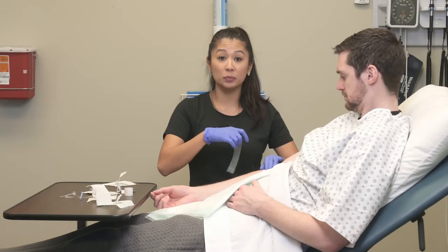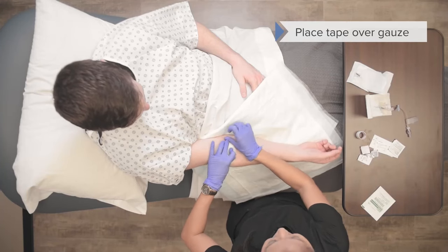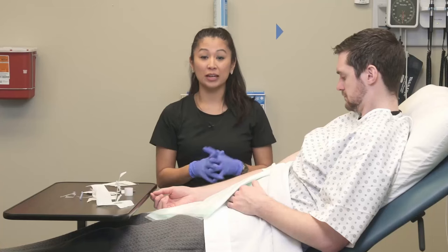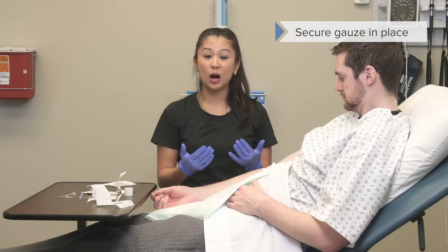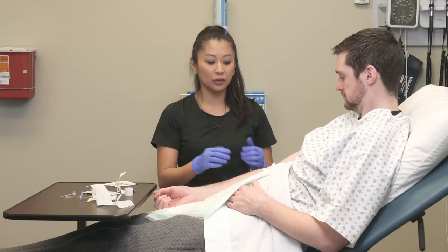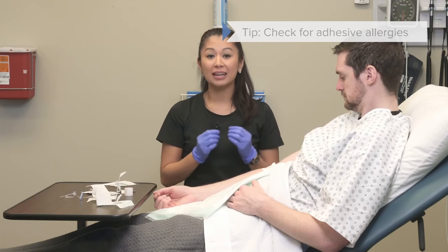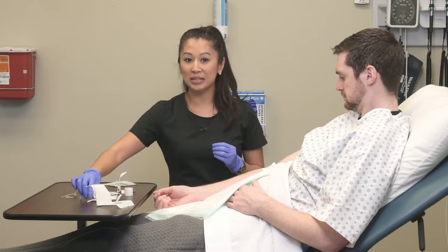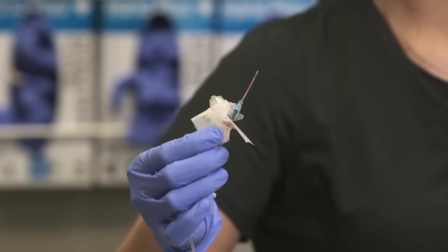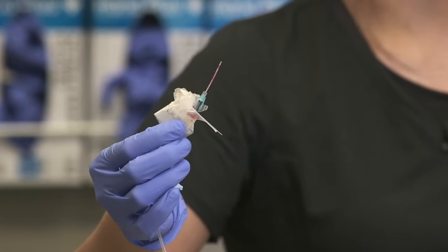Once pressure has been applied, I'm going to take my tape and put it nice and taut across the patient, then leave that there for them to discharge home. If your patient is allergic to adhesive, there are other alternatives you can use instead of this porous tape. Also, a common misconception: this is not a needle, so it does not need to go into the sharps box — depending on your facility, you can usually just throw it away in the trash.